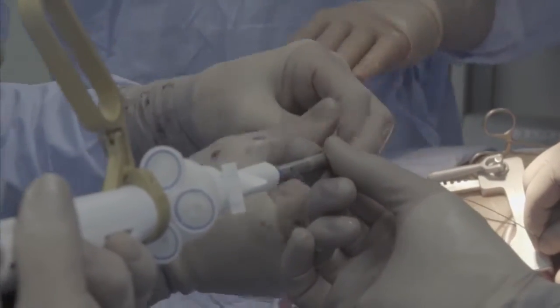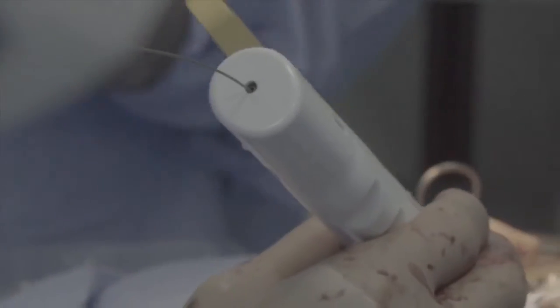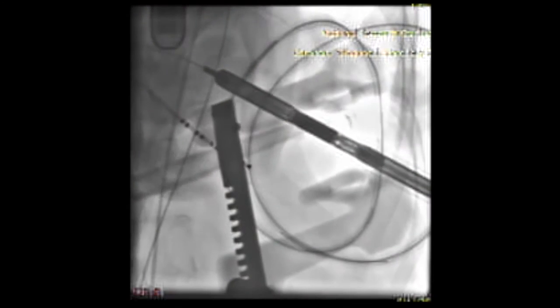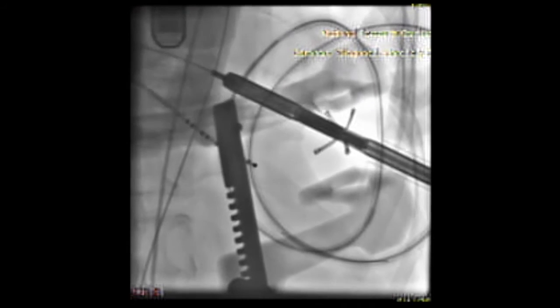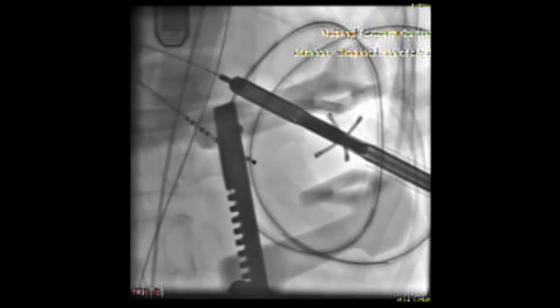Here, you will see the guide wire being placed through the distal end of the device, or the tip, which then comes out on the back. This wire is used to guide the tip of the HeartStitch TA into the apex of the heart. Once it's up against the apex of the heart, the arms are opened, as you see here.